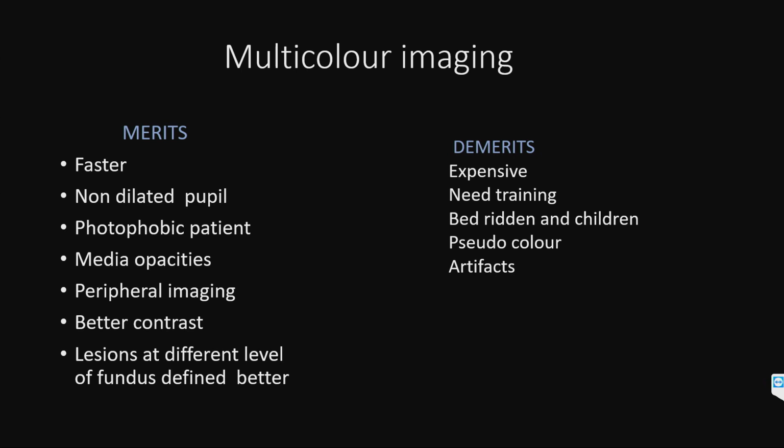The demerits are, it is expensive, needs a little bit of training to take the image, and pseudo color and artifacts are something which have to be looked into.